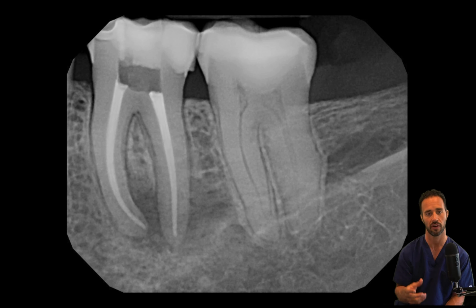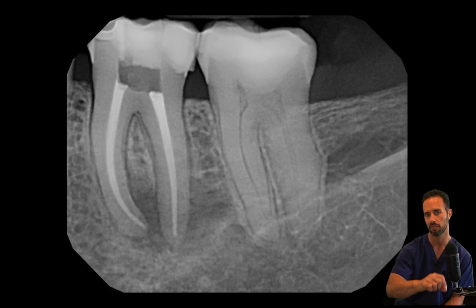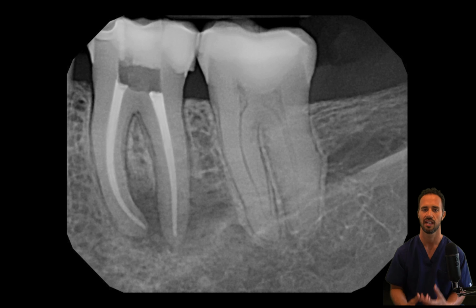We expect the apical periodontitis to heal over the next 3 to 12 months. We'll get this patient back for a recall appointment to ensure that the bone has filled into that lesion. But we expect nothing short of that. And you can appreciate the nice smooth walls in our access preparation. A lot of that is accomplished with the Endo Zebra, but this is a prototypical case that I see in my practice that you can very easily treat once you've developed the confidence and the training and the knowledge to handle this, which is what this training program is intended to do for you.